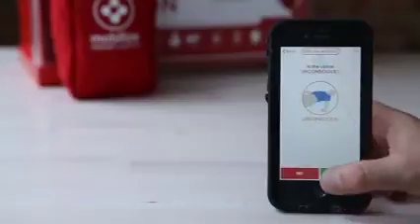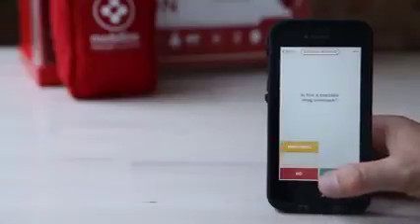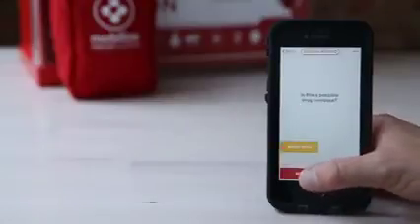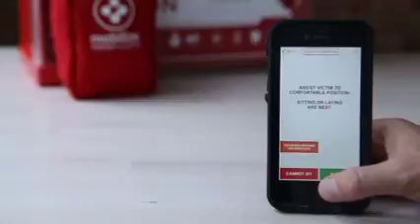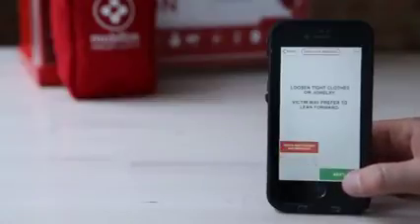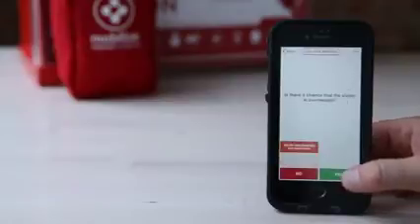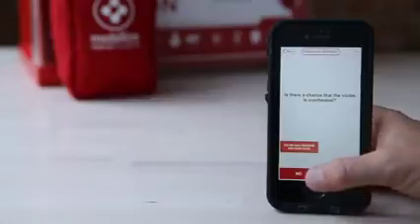Is this victim unconscious? No. Is the victim choking? No. Is this a possible drug overdose? No. Assist the victim to a comfortable position. Seated or laying is best. So we're going to sit. Loosen any tight clothing or jewelry. The victim may prefer to lean forward. And is there a chance that this victim is overheated?